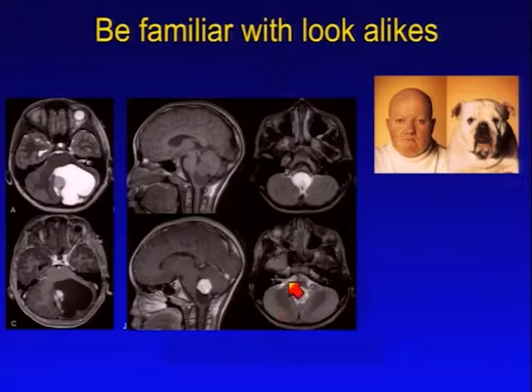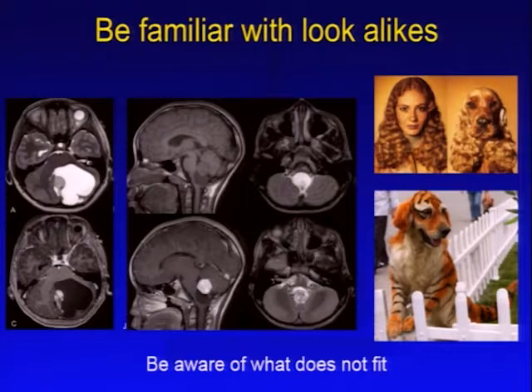But okay. So if you look at this tumor, something is different. So always study your images carefully. Something does not fit. It looks like a dog, or maybe not, but you recognize something is wrong here. You have to recognize what is wrong here. I'm not going to tell you what it is yet. But look at those vessels. There are too many vessels.